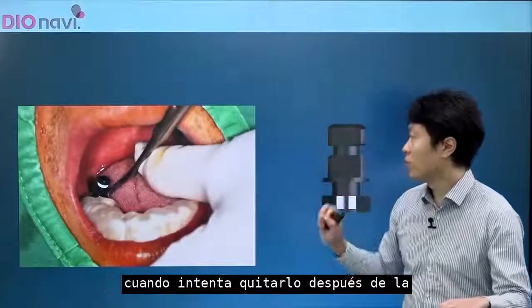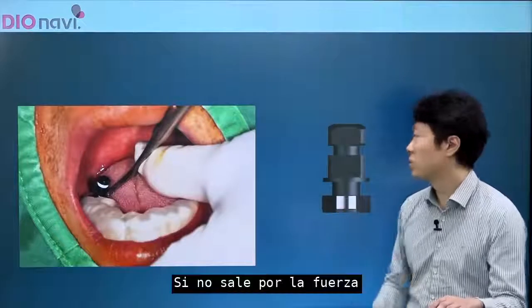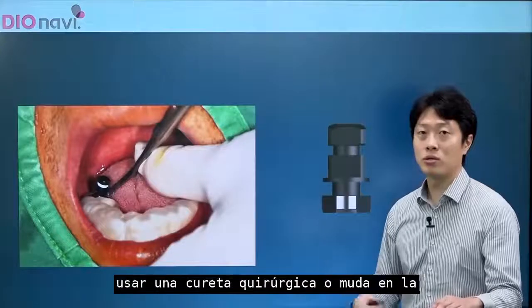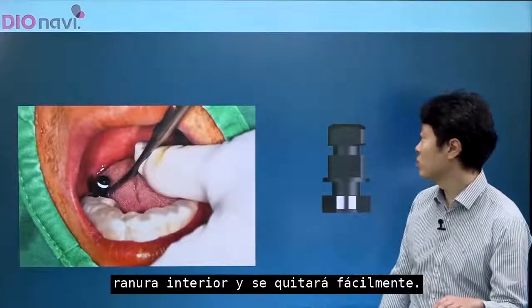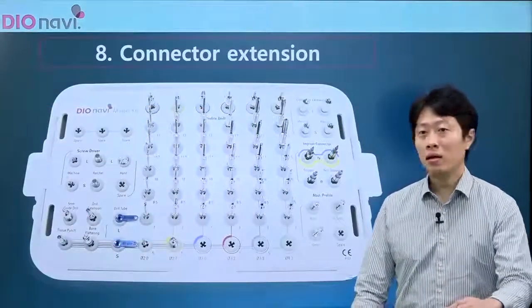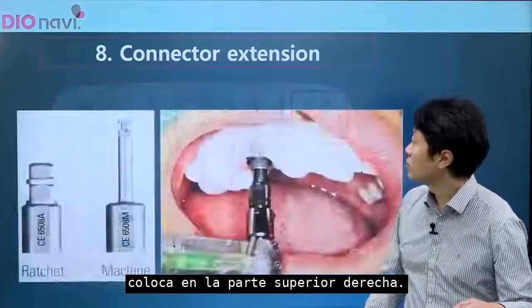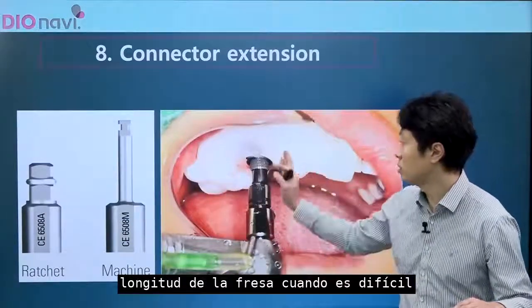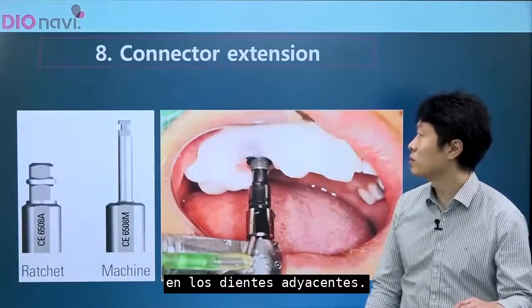Sometimes the drill may not come out when you try to remove it after placement. If it does not come out by force, apply the principle of the lever to use a surgical curette or molt on the inner groove, and it will easily be removed. The connector extension drill is placed in the upper right part. This drill is used to extend the length of the drill when it is difficult to place an implant because it gets caught on adjacent teeth.